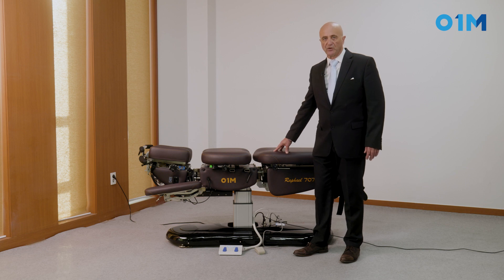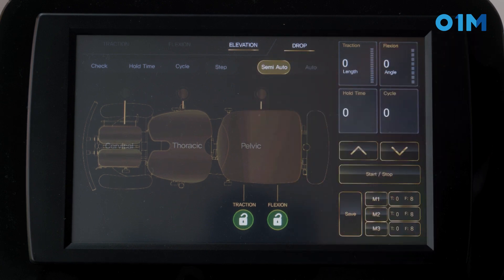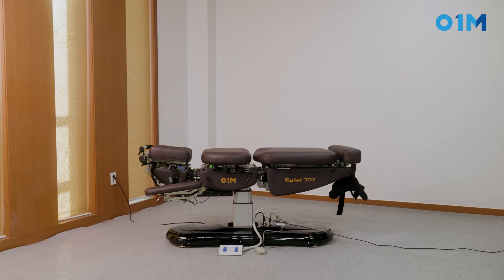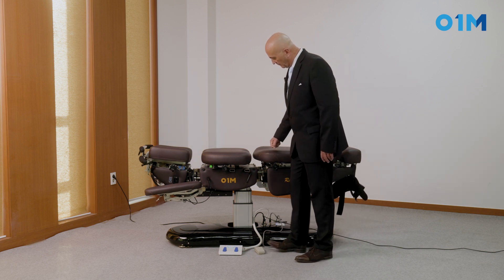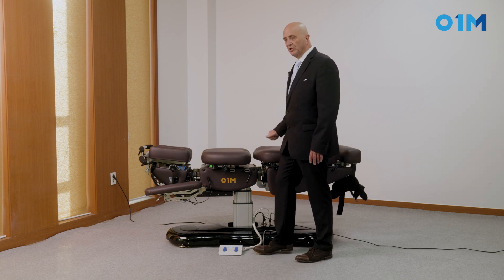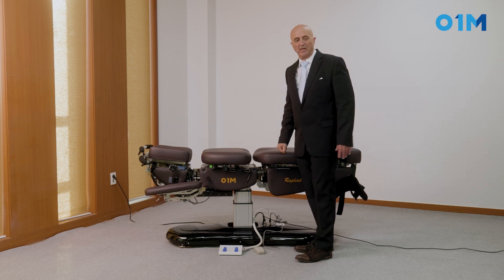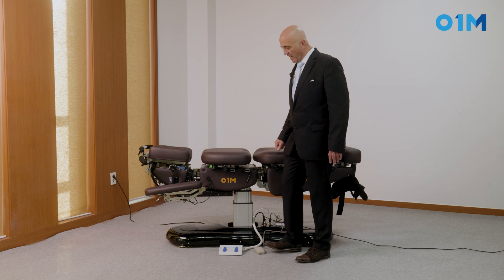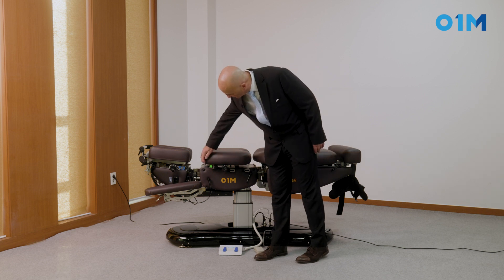I can use the drops in manual mode as well. I select manual, and now I'm going to raise the pelvic drop using the foot command. Once in manual mode, I use the foot command to raise the drop. If I select the thoracic drop on the screen, it works exactly the same way, and I just need to click to bring it down.